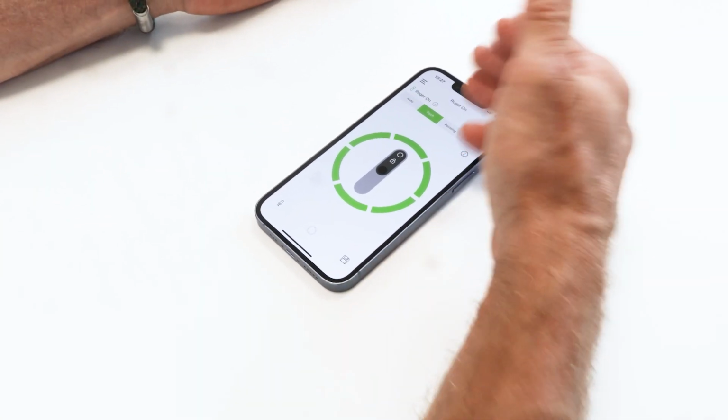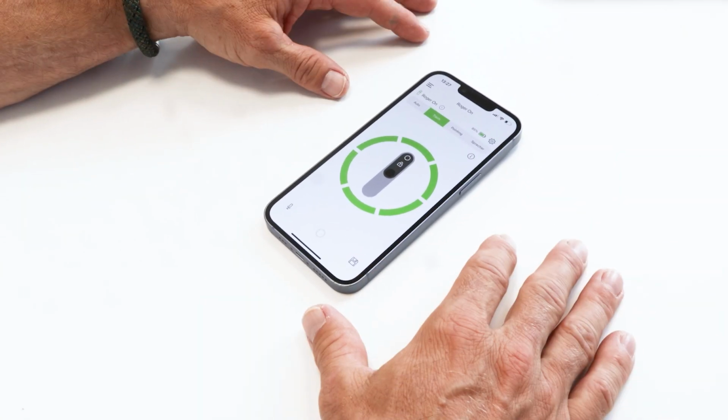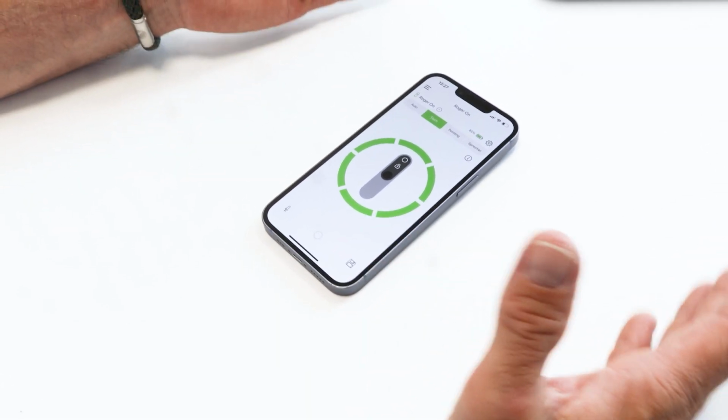First, with the My Roger Mic app. It includes a beam steering functionality that allows users to steer the beam in the direction of a specific talker. This increases the volume of the selected talker while reducing the background noise. There are 6 beams that can be selected or deselected. Here is how it works.